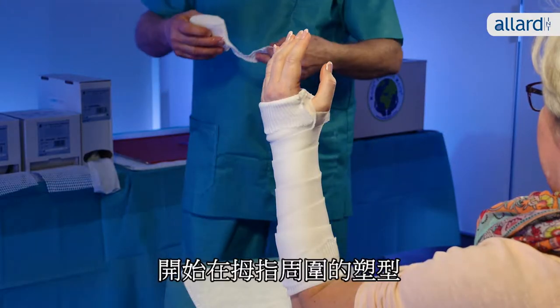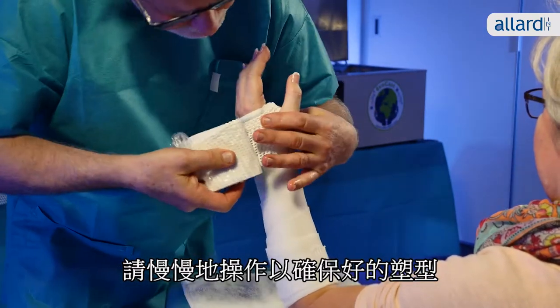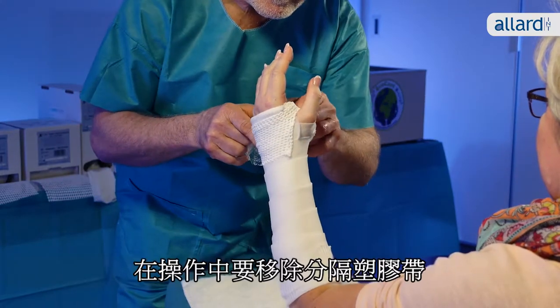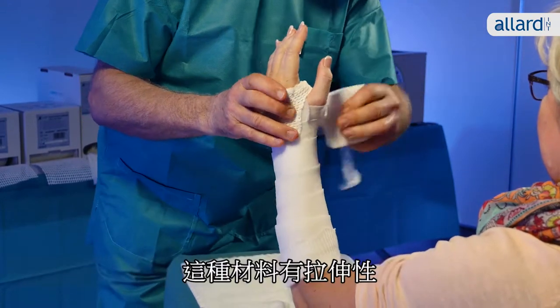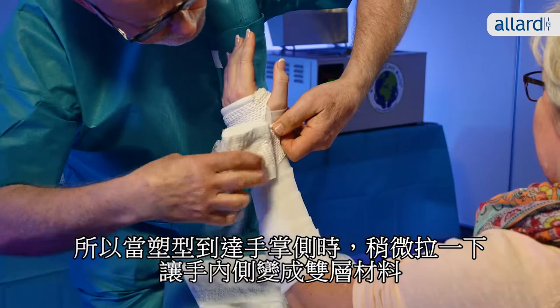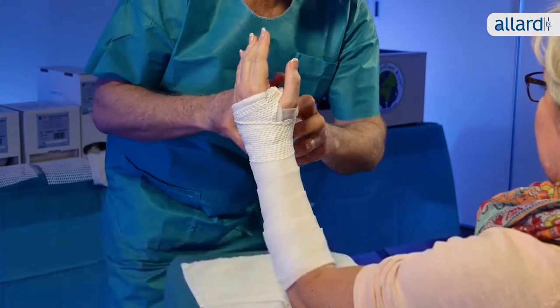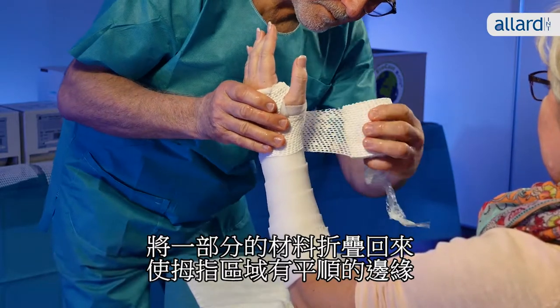Start your casting by placing the material around the thumb area and take your time to ensure a nice fit at the distal end of the cast. While working your way around, remove the plastic separator. The material will stretch, so when you reach the palmar side, pull it a little to make a double layer inside the hand. Fold a little part of the material back when you reach the thumb area for a smooth edge.